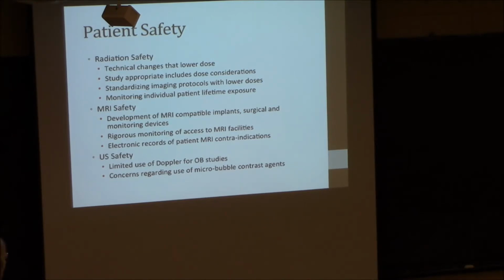Okay. So now I want to talk a little bit about patient safety, because we spent a lot of time, and it's been so hot in the news lately, radiation safety being the primary one. Radiation safety, as I mentioned, a lot of newspaper articles about radiation burns and concerns about too much radiation in radiology.